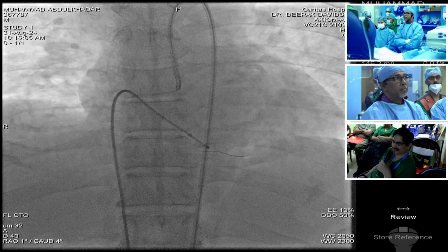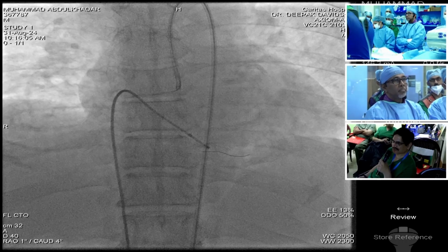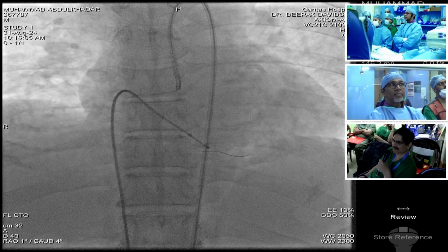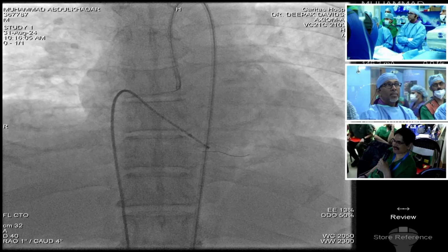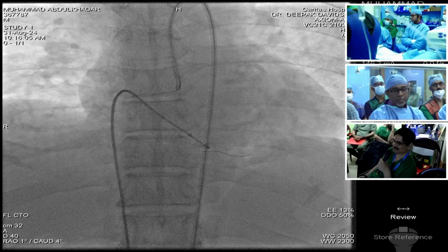Actually, Deepak, you can park the burr near the lesion only. You can park actually. Yeah. Because of Brady, we pulled it up and it's somewhere close to the catheter. Because we thought that once we start the burring, we'll move forward. Sure.